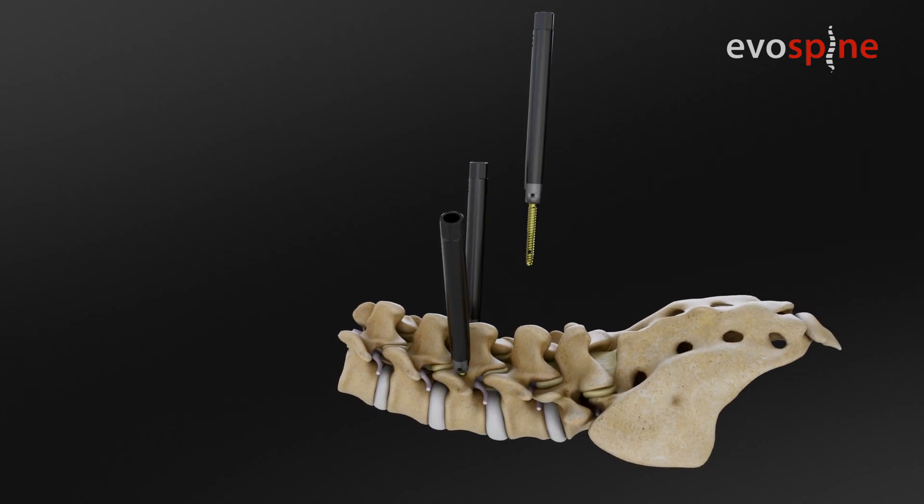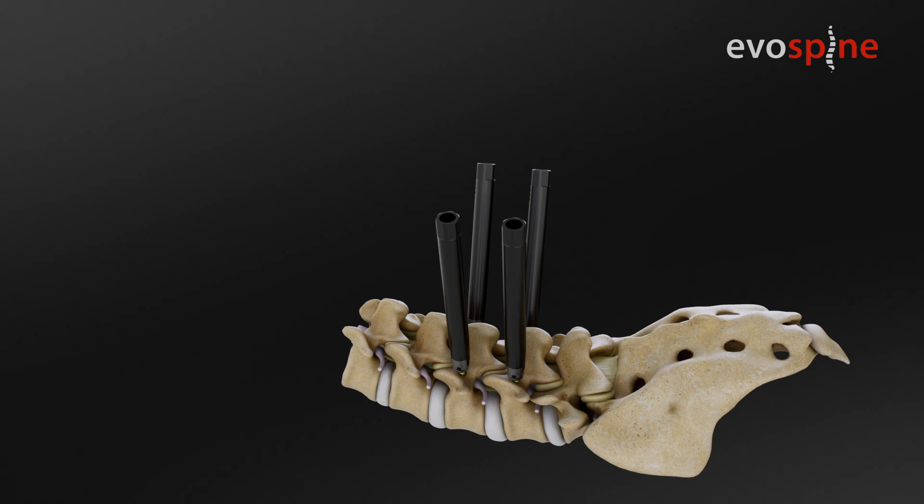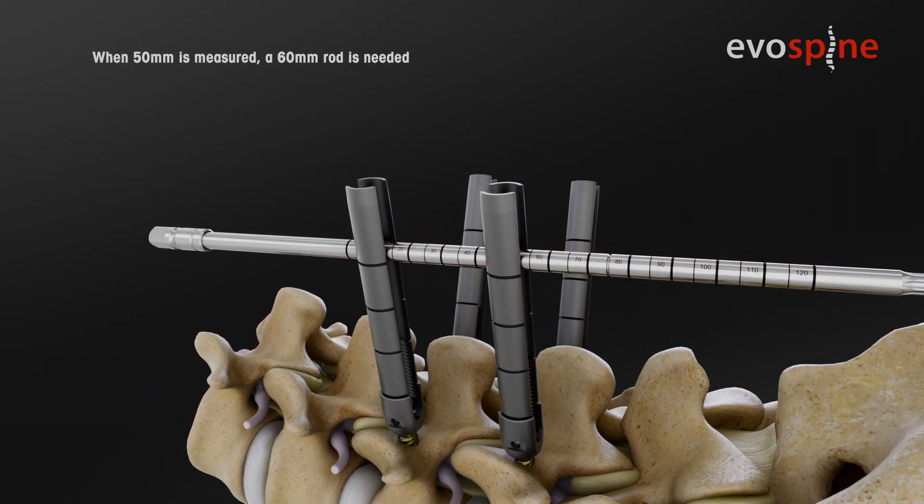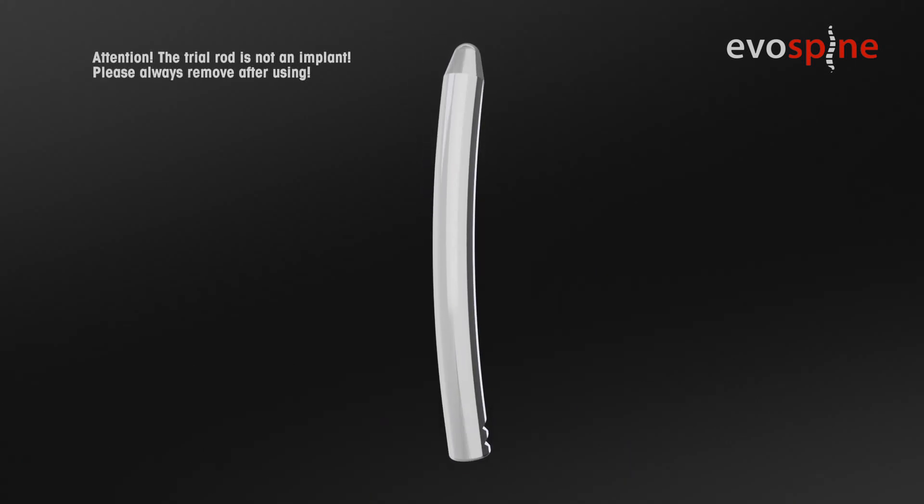Repeat points 2 and 3 until all screws are in place, using the small thin Torx driver with laser marked scale on it, or by using the trial rod inside.